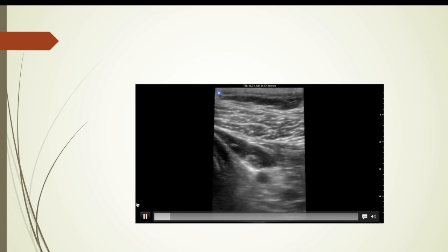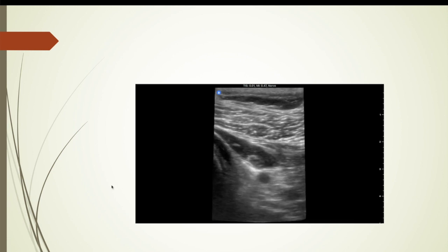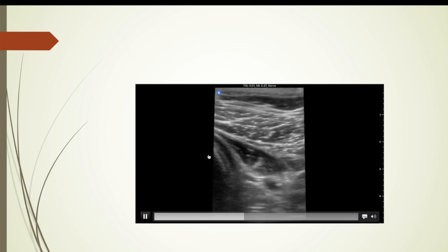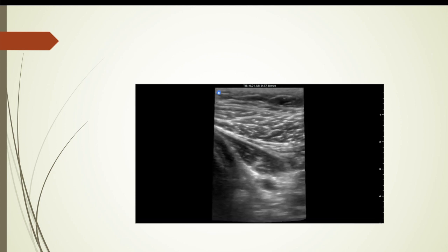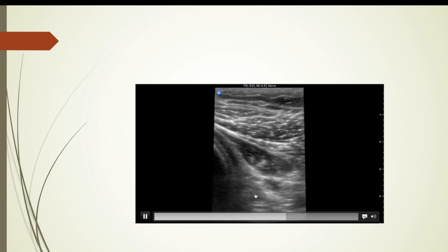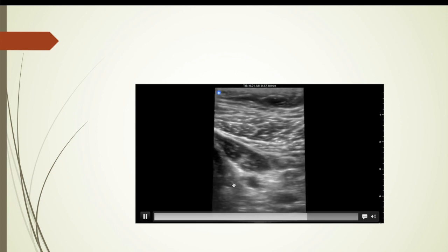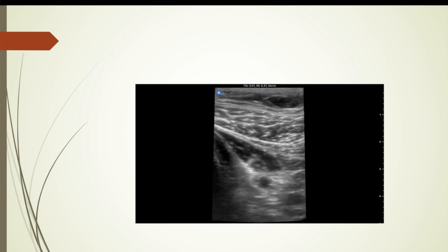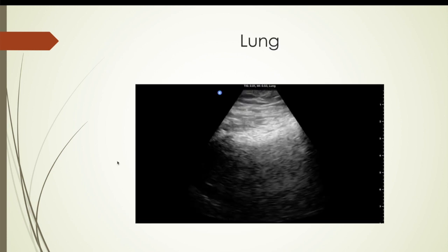Here are a few scans I did. This one is an infraclavicular block — I just did the anatomy scan, and I tend to go more lateral as you can see. You can see pec major, pec minor, and the cords around the axillary artery. The view is excellent, and this was my first time using it with the nerve preset setting.